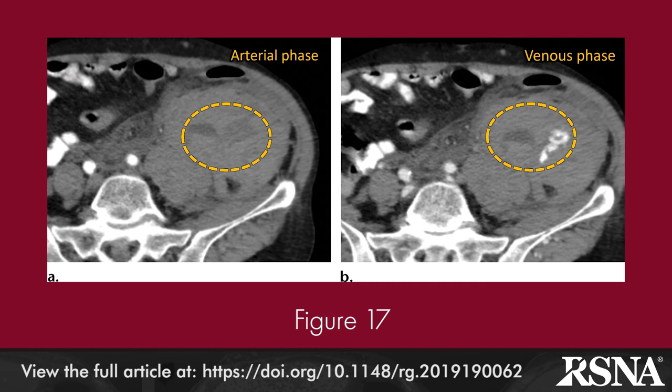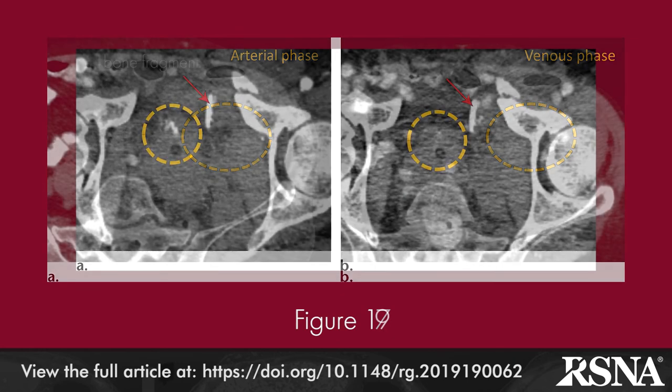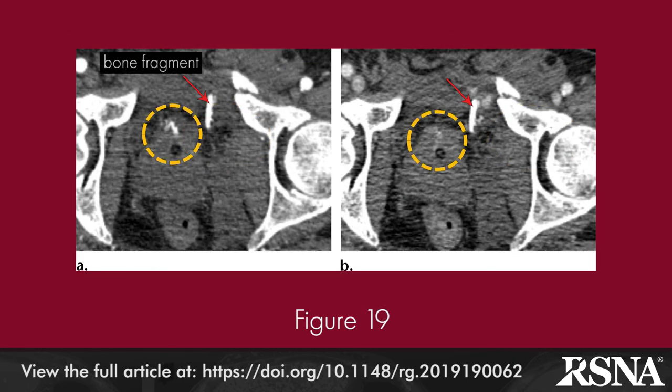Pitfalls that may lead to misdiagnosis of pelvic vascular injury may be due to improper technique, patient-related factors, or artifacts. Bone fragments may mimic vascular injury but can be distinguished from bleeding on multi-phase scans, as shown in Figure 19.